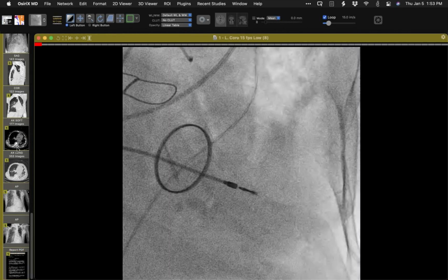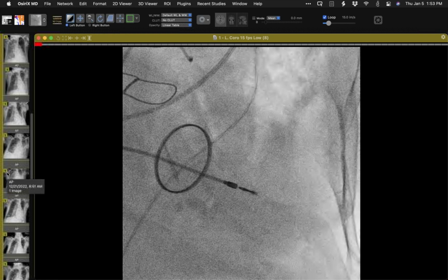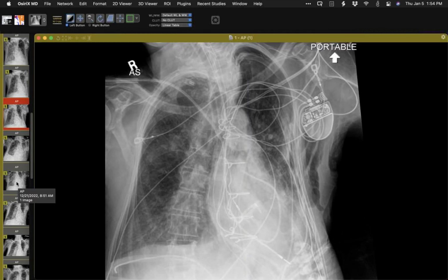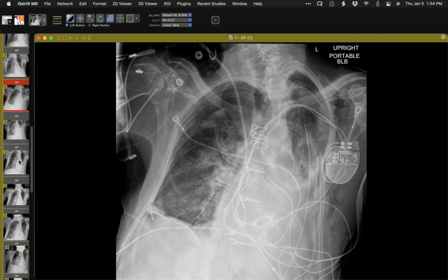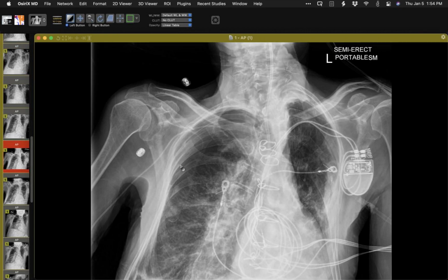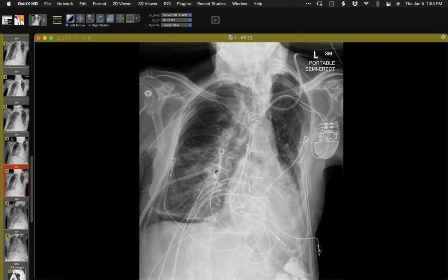Now he's had a stormy post-op course and has been here for quite a while. And I'm going to show you a couple of images. I will tell you, because there's tons of images here, that he's had repeated pneumothoraces post-op on the right side that, in reading daily radiographs, seem to be quite hard to manage successfully. So I'm going to go forward in time to show you that he had conventional chest tubes post-op, fine. And then you can see here that he has a pneumothorax over here, and eventually he got a pleural space catheter.